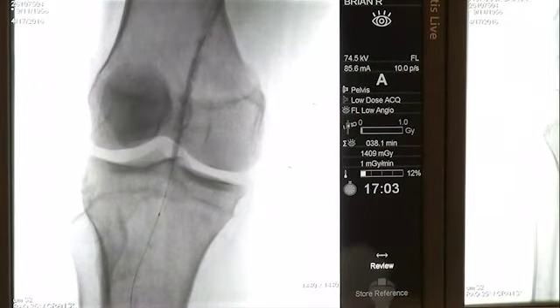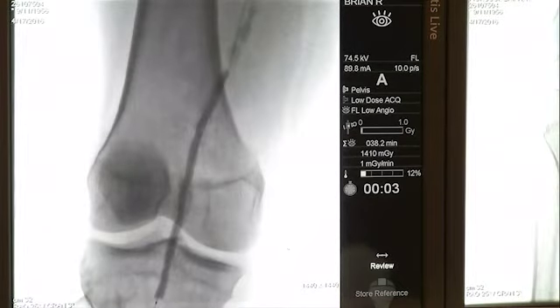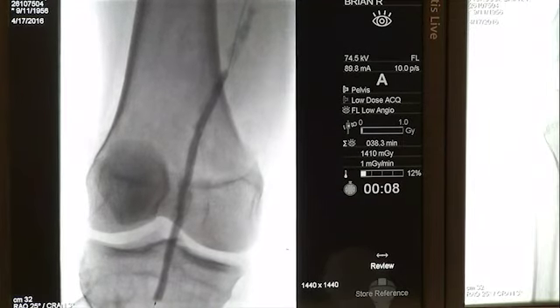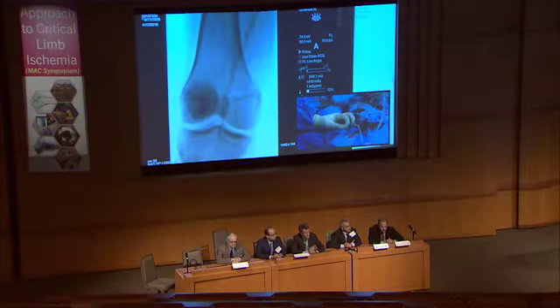Where I see a role for atherectomy is the distal popliteal lesion, to prevent any plaque shift into the anterior tibial. So cleaning this area with focal atherectomy would make the most sense here. You're talking about just distal, not the whole SFA? No, the popliteal, just the area proximal to the bifurcation into the trunk and the AT. So that would be something for directional atherectomy, for example.